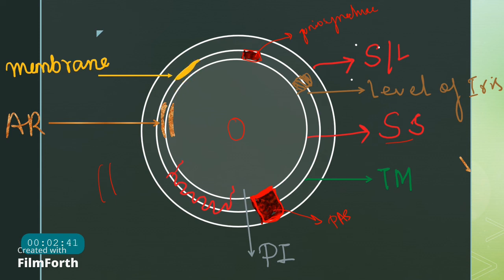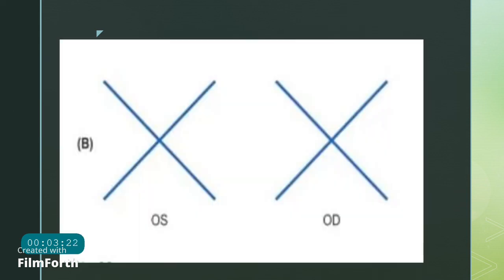Then the membranes are usually drawn in the trabecular meshwork area with yellow pigment. If there is any peripheral iridectomy or iridotomy, it can be drawn in black pencil on the iris. Apart from that, the level of iris insertion should also be represented in a brown color, but the only difference is that you have to represent it with oblique lines. The PAS or the goniosynechiae can be represented with full colors or horizontal lines, but to depict the level of iris insertion, it's better to use oblique lines like this. That will tell you the level of iris insertion.